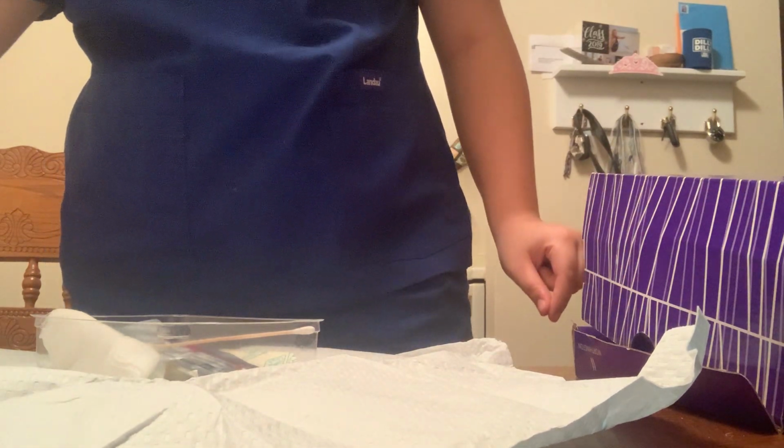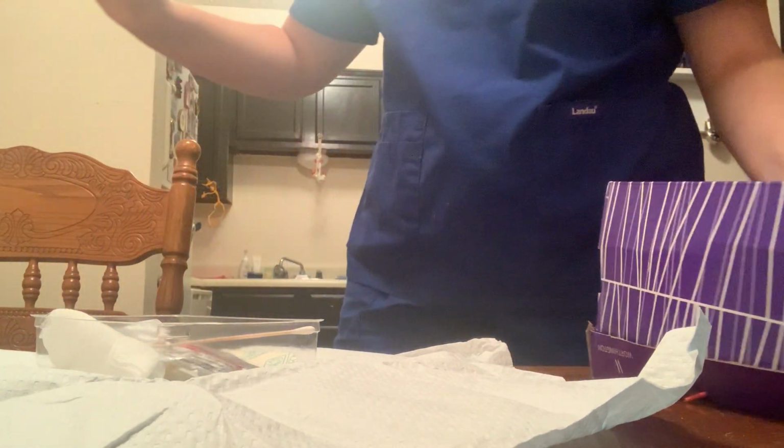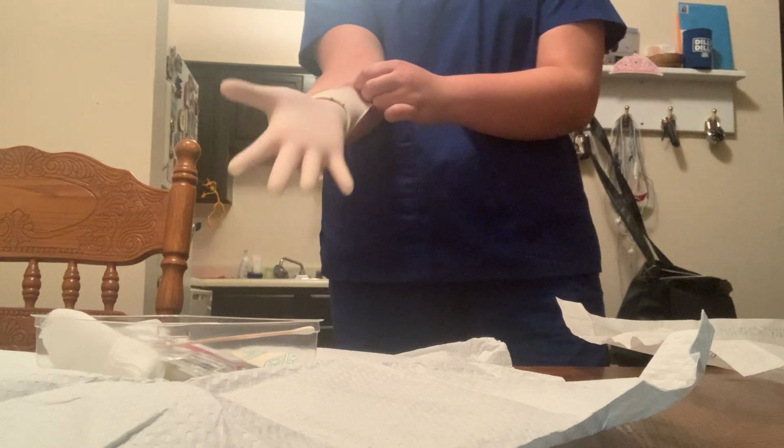Next, I would apply my sterile gloves. I'm going to just move my CVAD real quick and do that over here. I'm using a scoop method to put on the other glove.